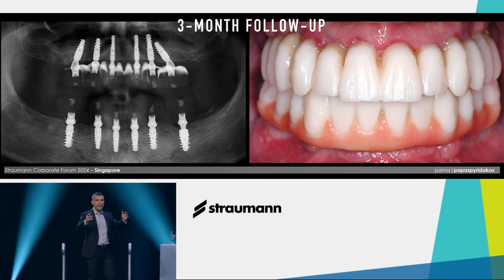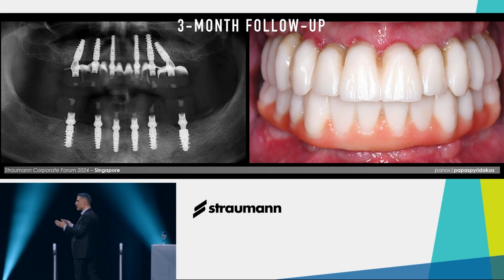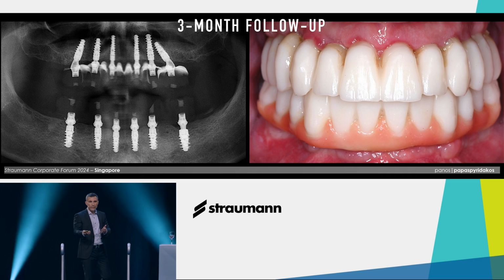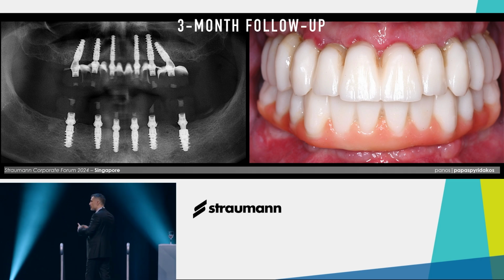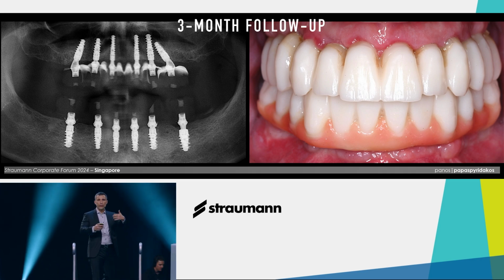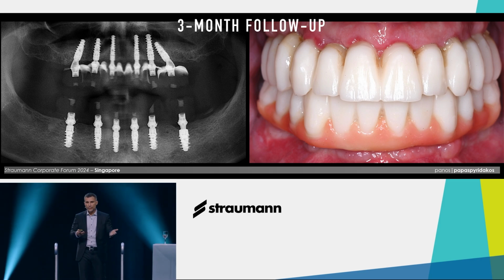Three months passed by, and the patient comes back to assess and confirm the osseointegration. So now, after confirmation of the osseointegration, we need to move forward. We can do it with an analog workflow or with a digital workflow. The analog workflow takes about 5 visits. It starts with 2 impressions. We take an impression of the provisionals. We remove the provisionals. We take an impression of the teeth, of the implants.